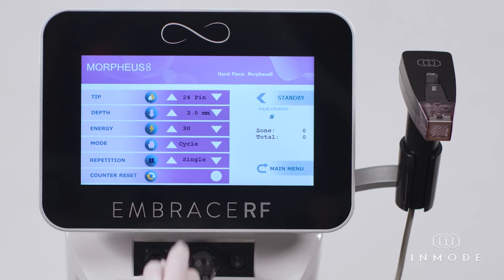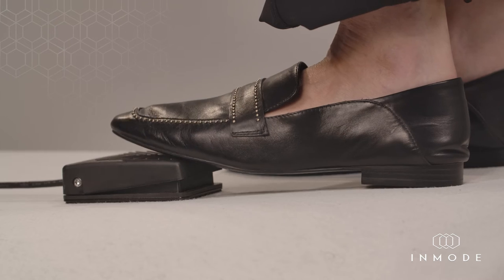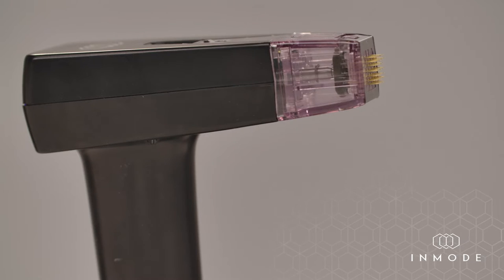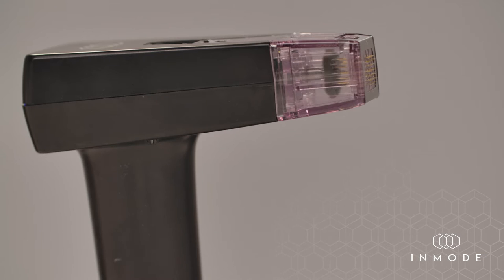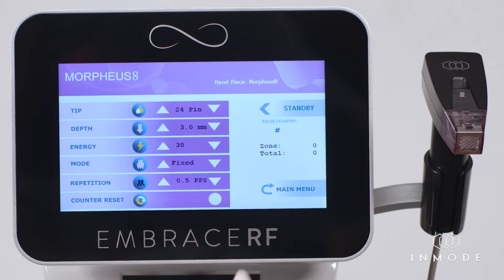There are different working modes to choose from. Cycle mode: needles penetrate and retract from the tissue with every pulse. Fixed mode: needles are continuously deployed at programmable depth while the foot switch is activated. The needles retract back and energy delivery terminates once the foot switch is released. It can be used for the stacking of pulses when required.